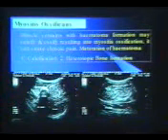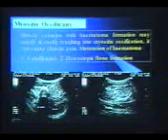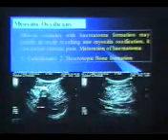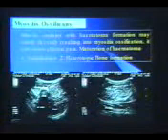This is the arm, this is the humerus bone which is cut here, this is the normal compartment, and this is the myositis ossificans. A well-defined, highly echogenic mass having punctate calcification is seen here in myositis ossificans. So all this we can see here.